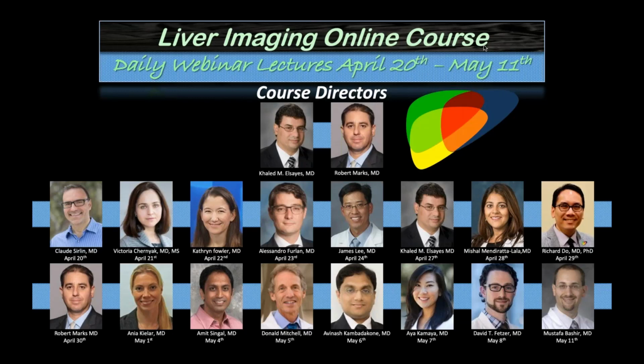We tried to do a research study actually on this topic, where we tried to quantify the de-enhancement of a lesion and see if we could come up with an objective definition of washout. And one of the challenges is that the liver itself is heterogeneous. So when you place a region of interest, the lesion is heterogeneous and the liver is heterogeneous.